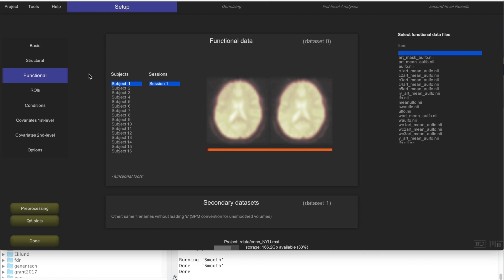Let's recap what has happened so far. In the previous video, we downloaded the NYU test-retest dataset. This is a pure resting state dataset, and we created a CONN project where we imported both the functional and structural data. We have preprocessing, which involves realignment, slice-timing correction, outlier identification, normalization, segmentation, and smoothing.